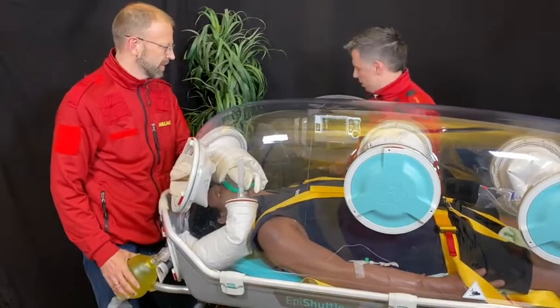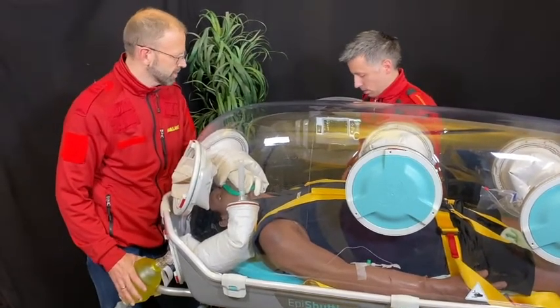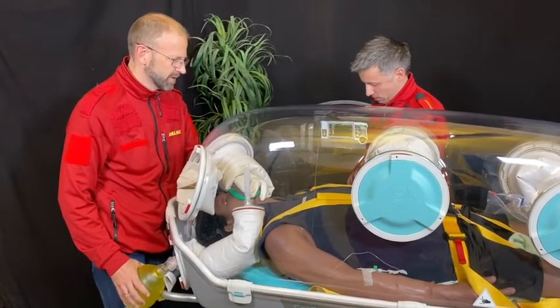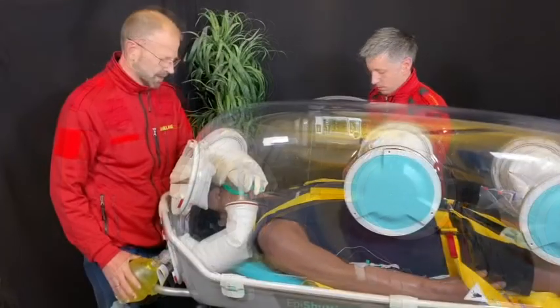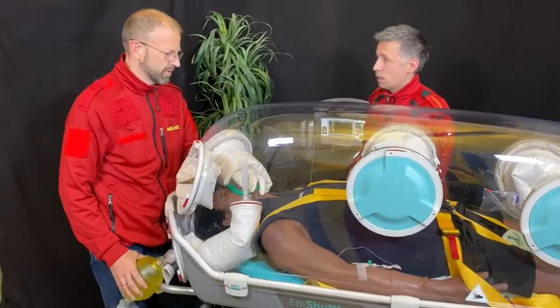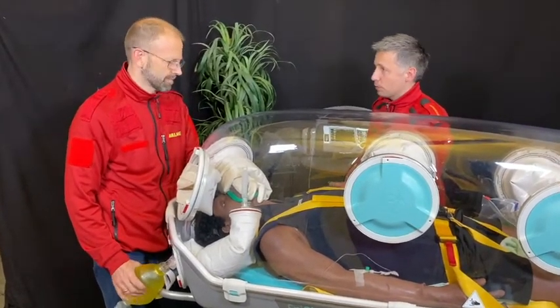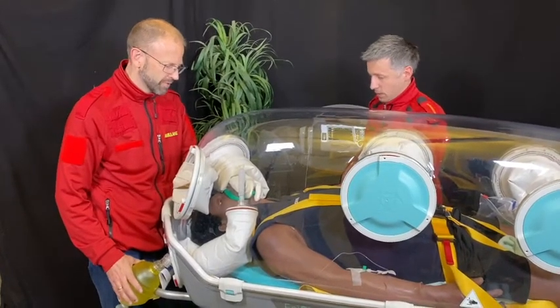And then we continue with ketamine, 100 milligrams of ketamine. And then also the suxamethonium, 100 milligrams of suxamethonium.